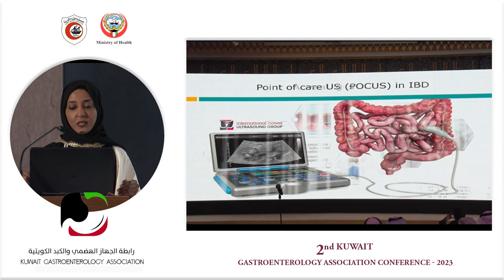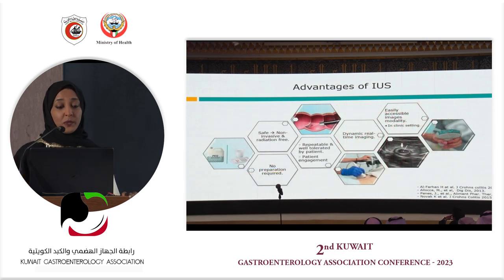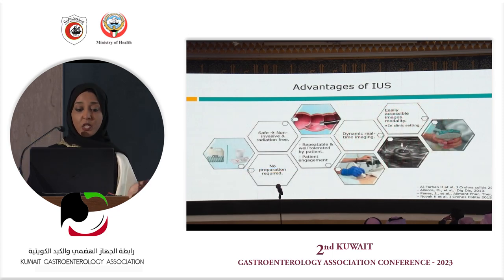So focusing on point of care bowel ultrasound, why do we like it? We like it because it's safe, non-invasive, doesn't need any sort of preparation, it can be repeated very frequently, and it is well liked by patients and keeps them engaged. It's dynamic: if the patient presents to your clinic with any symptoms, you can scan him within 15 minutes to get the diagnosis of whether he's having a flare or not. And it's easily accessible, so you can just pull the machine from one clinic to another.